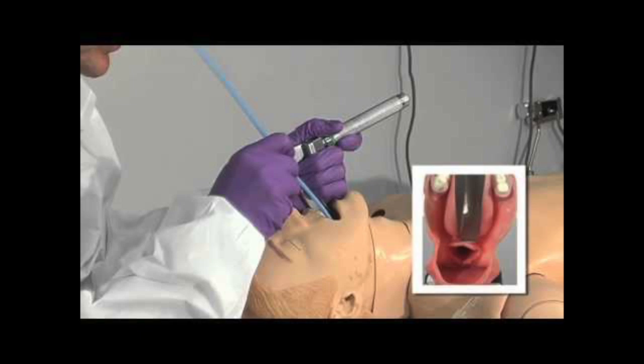It just happens to be blue. It's a probe, if you will, with a little hook or tip on the end of it that is slid into the vocal cords. And for us, it is a guide wire of sorts to be able to pass that ET tube through. So if I have a difficult intubation, or more specifically, what this was designed for was the difficult intubation. Now, quite frankly, and standard of care, I use it for every intubation. I don't care if it's easy or hard. That tends to be the policy now traditionally across the country. But I'll take that bougie for every patient.